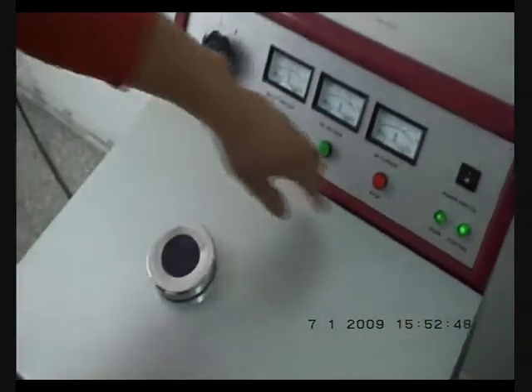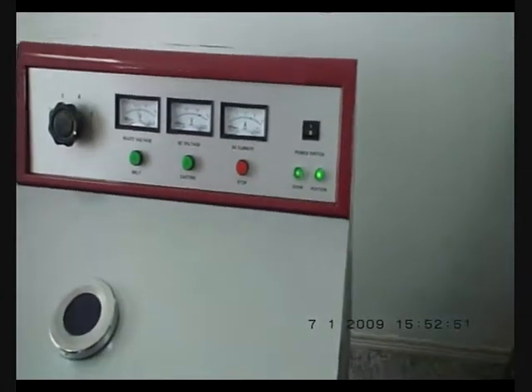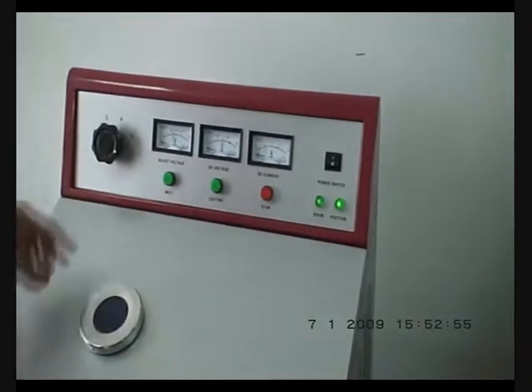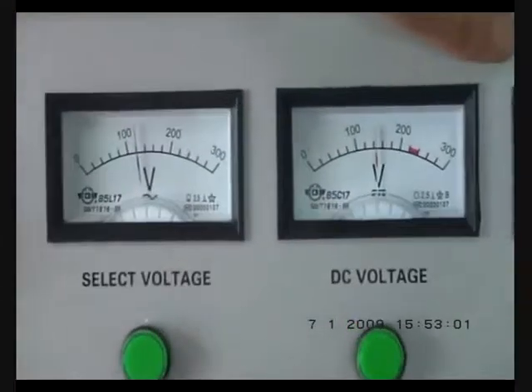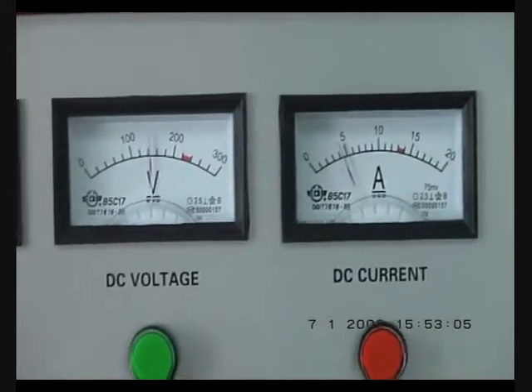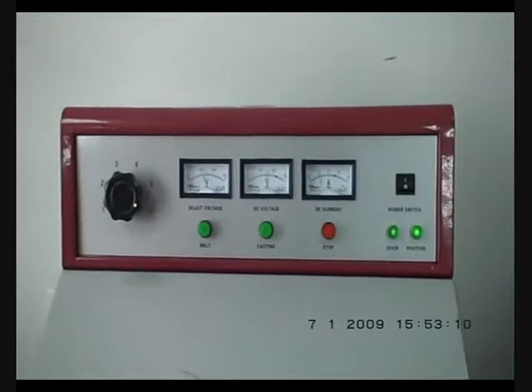Close the lid. You can see the door and the position lights are both on. Now you can press melt. The three readings should be 120, 140, and 4 ampere. If the readings are at these three values, it means the machine is OK.